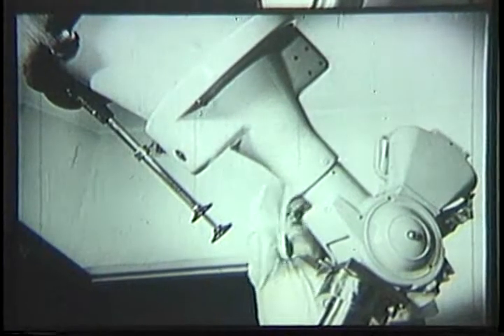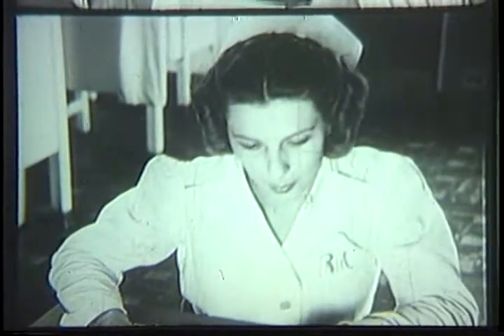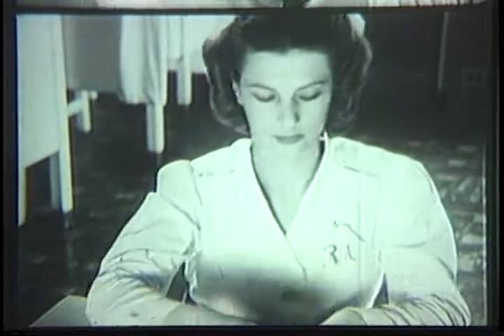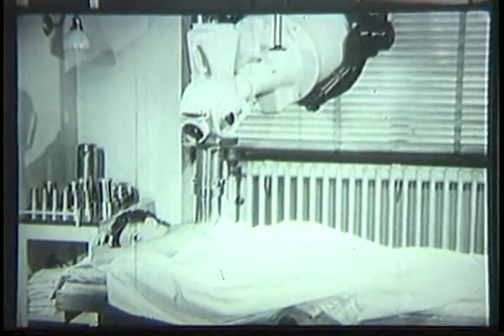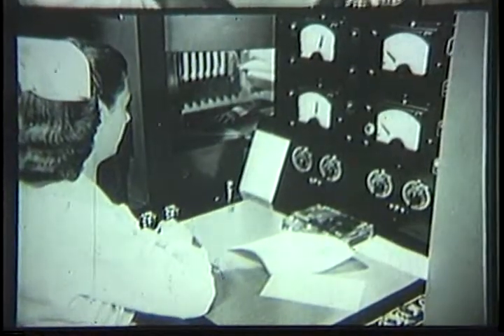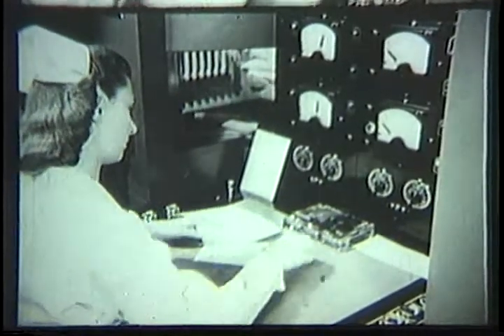The nurse technician who administers radiotherapy must have a precise knowledge of the equipment which she operates. She should also have an understanding of the physiological effects and psychological aspects of X-ray treatments upon individual patients. These qualifications are essential since the technician must cooperate very closely with the doctor, nurses, and others who are administering the medical and nursing care prescribed for each patient.